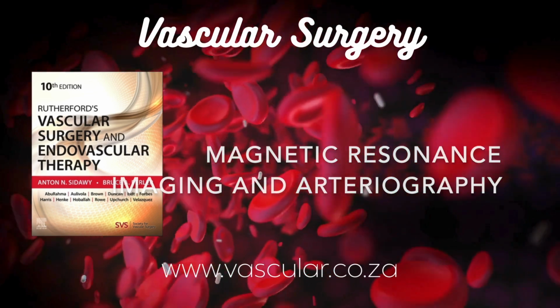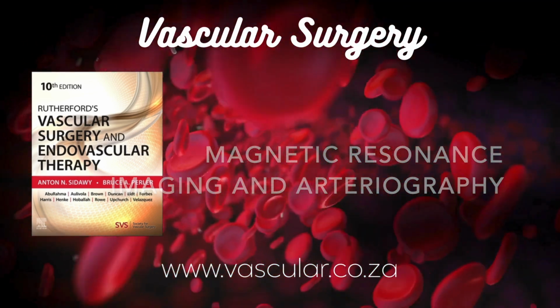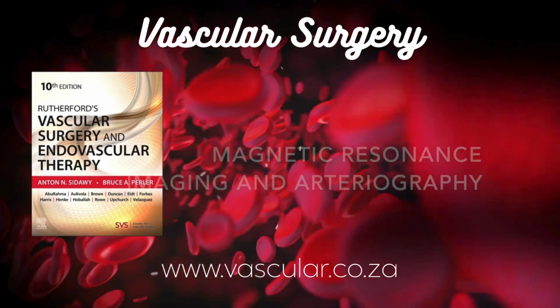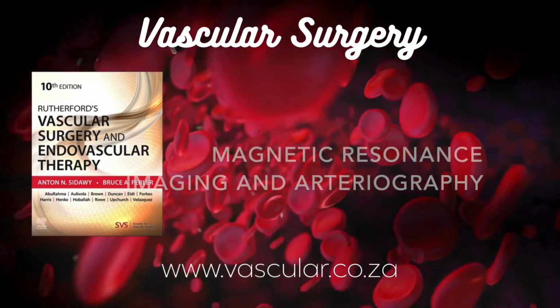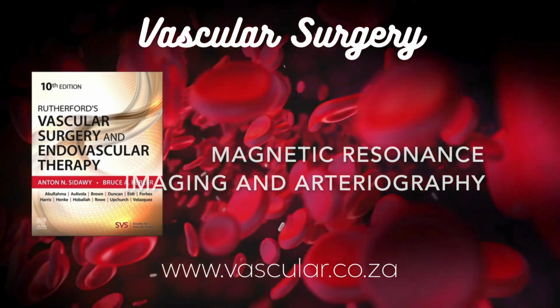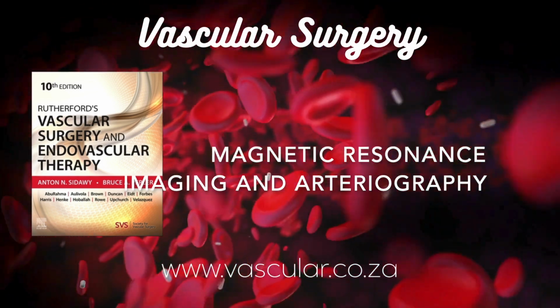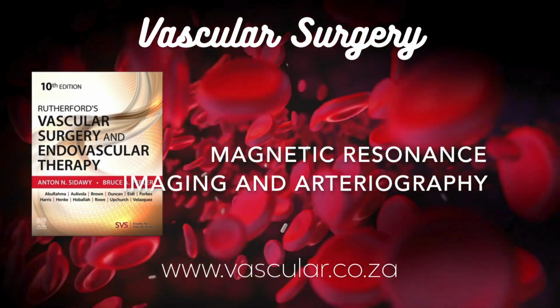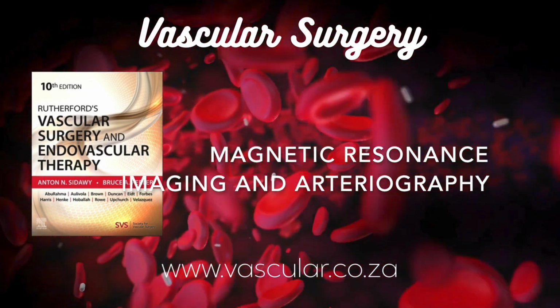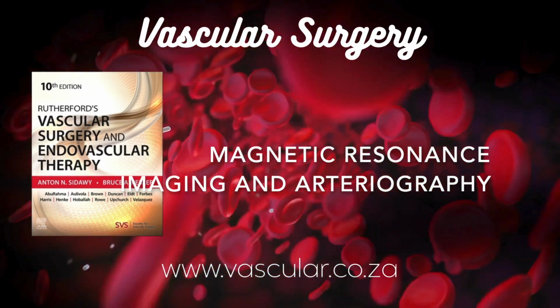Cool. The outline also mentioned compressed sensing. Sounds very advanced. It is pretty cutting edge. Compressed sensing is a different mathematical approach, again allowing us to reconstruct high-quality images from significantly undersampled data, meaning we collect much less data than traditional methods would require. Which means even faster scans. Potentially dramatically faster, yes. This is super useful in tricky situations like scanning kids who can't hold still for long or needing really short breath holds for adults. Compressed sensing is definitely a technology to watch in MRA.